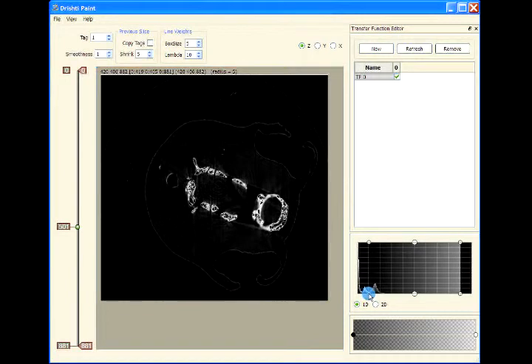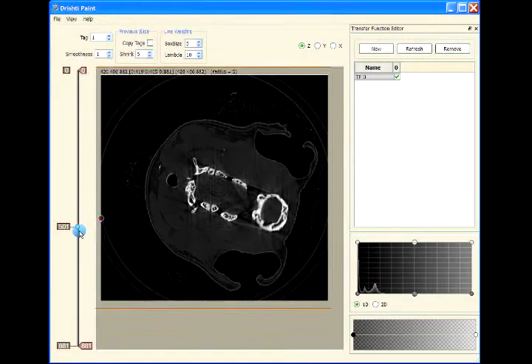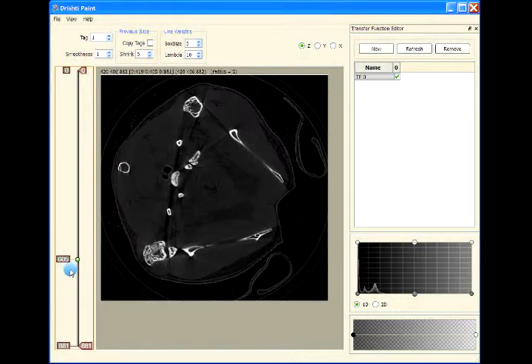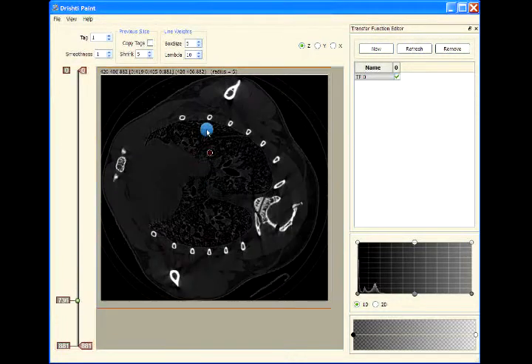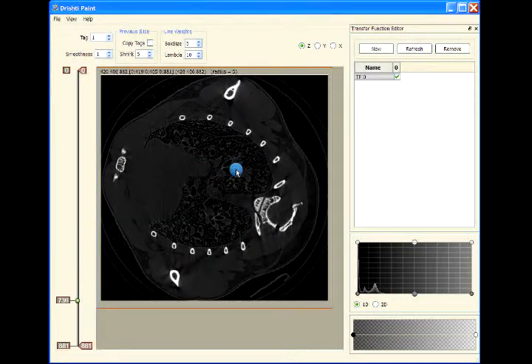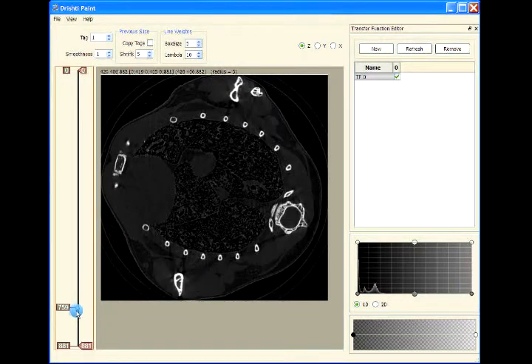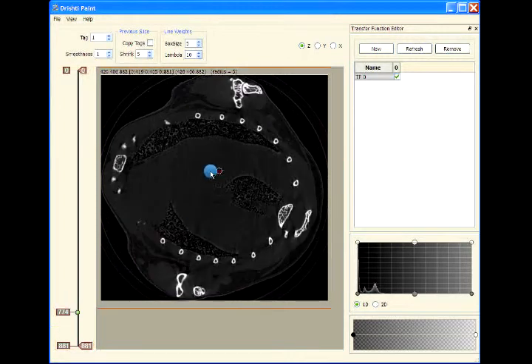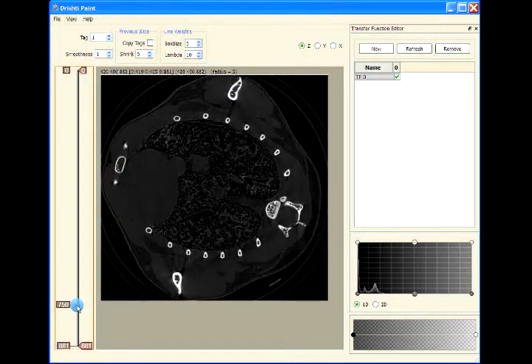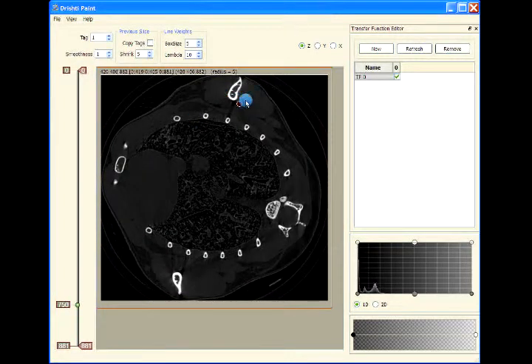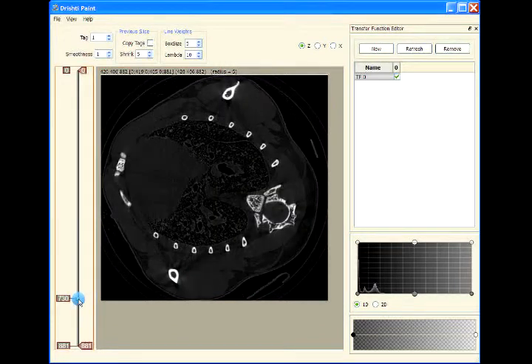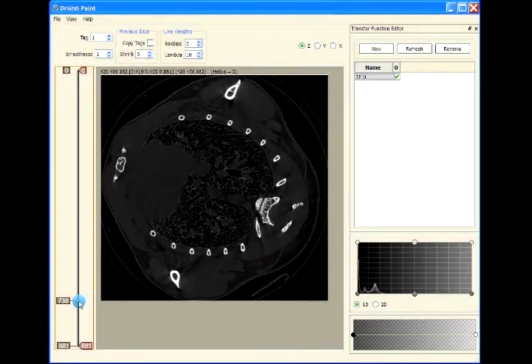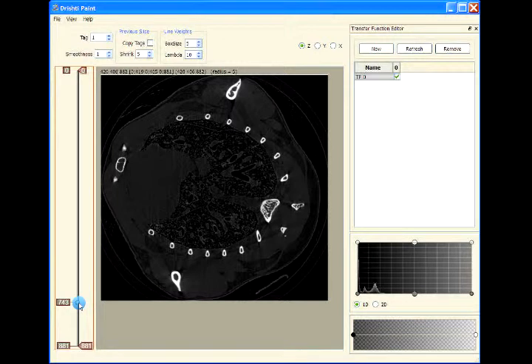As you can see, this data set is really very tricky. If you look at the lungs, the contrast is not very high. Also, if you see, there are a lot of ring artifacts and then there's a lot of streaking as well.